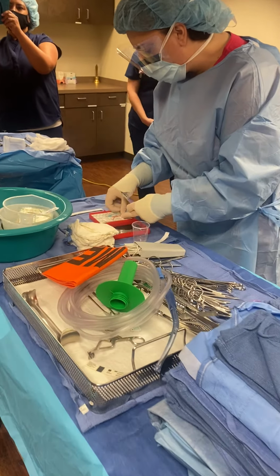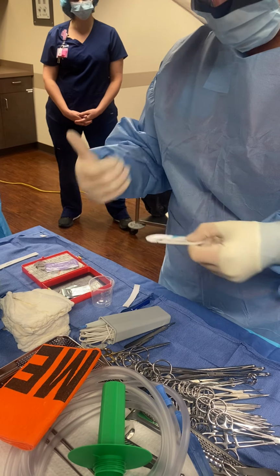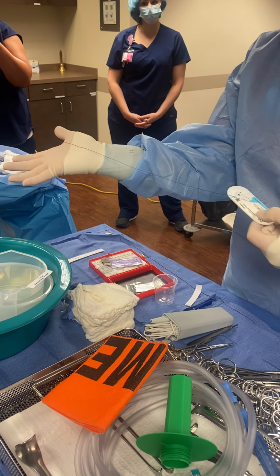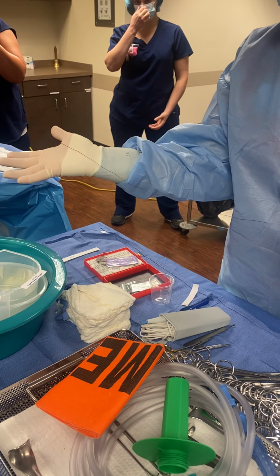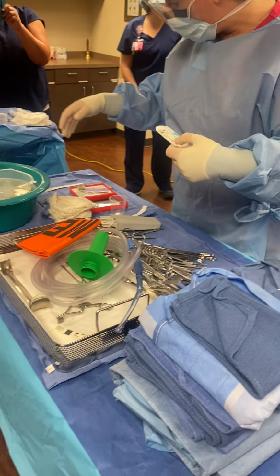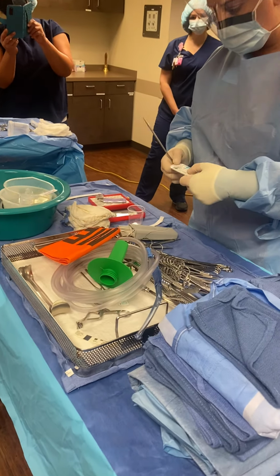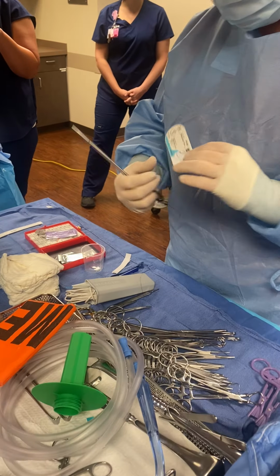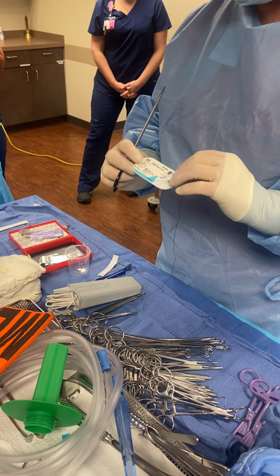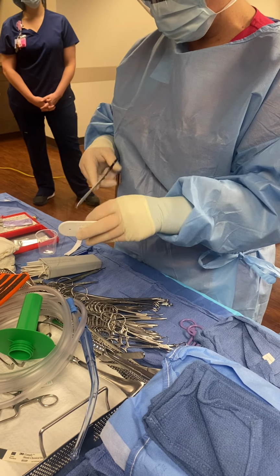So the first suture that the surgeon's going to want is the Vicryl suture, or no, silk. And silk is a black multi-filament thread, and it's non-absorbable, okay? And that's what she's going to use to mark the specimen with, the margins of the specimen. This is a 3-0 silk, and it's on an SH needle. SH is just a tapered, very common, like peanut butter and jelly, bread and butter, whatever you want to say.